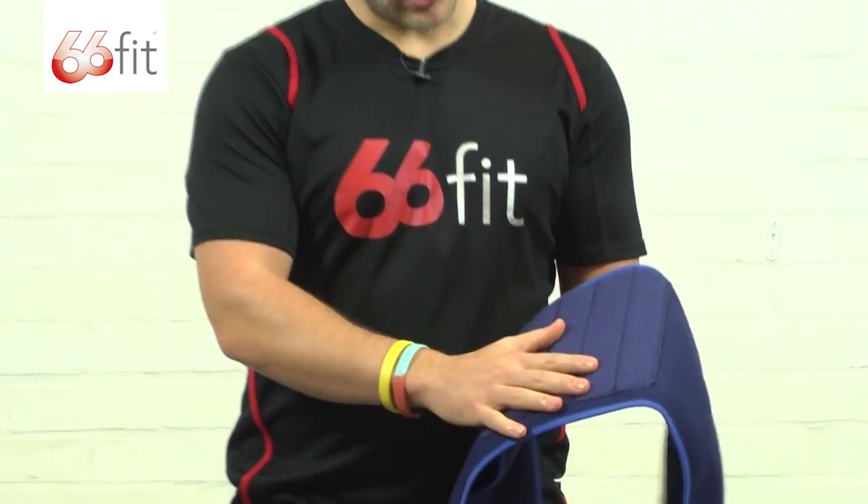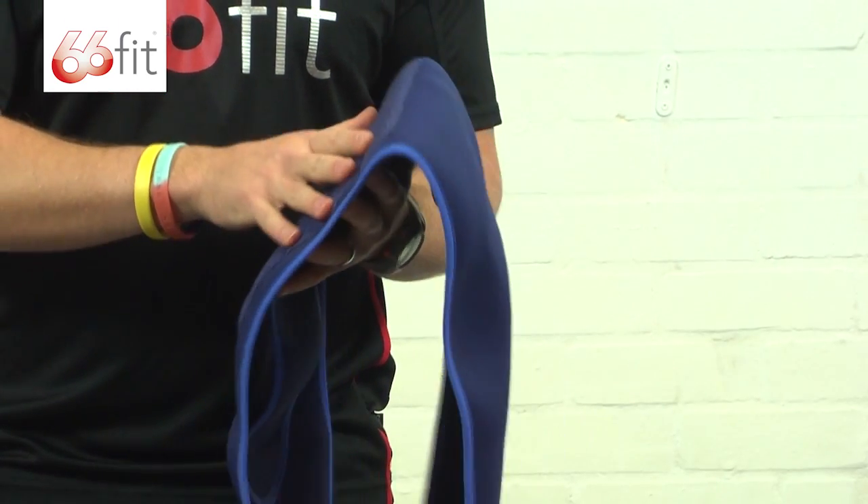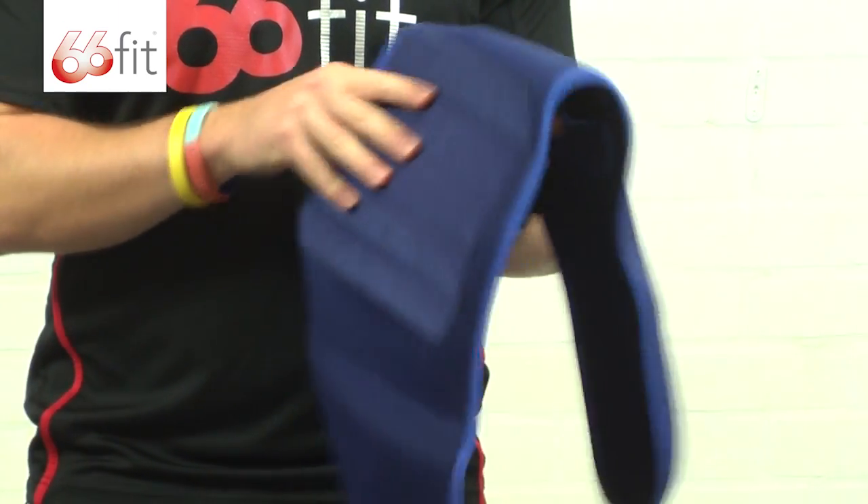Inside the brace you've got stitched into these little compartments additional metal stays, just to provide you with a little bit more stability.